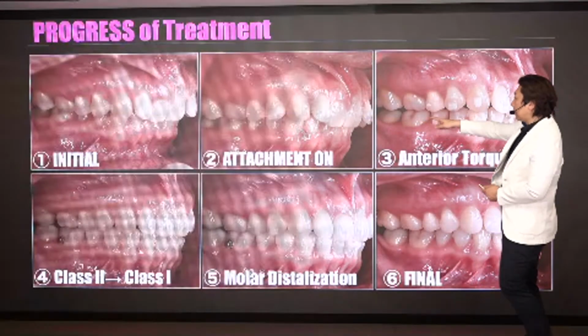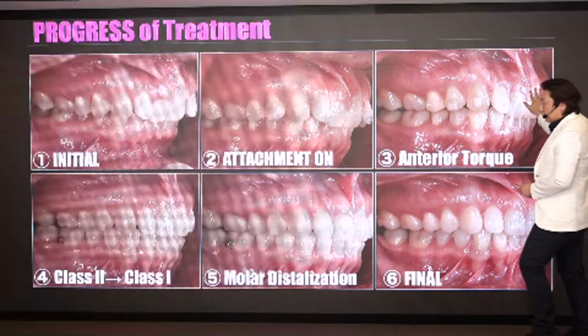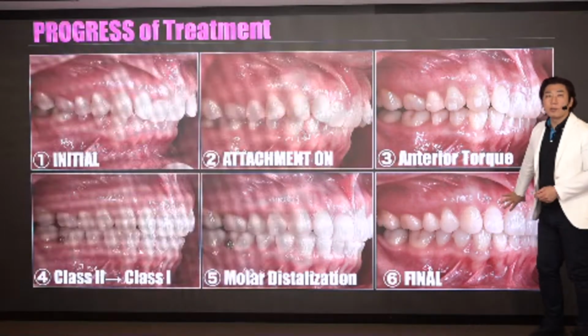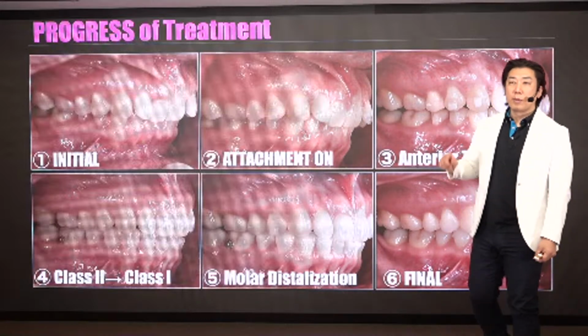This is the progress. Initially the attachments on, then we started the anterior torque control, then class 2 shifted to class 1, molar distalization, and this is the final situation. This is all aligners.